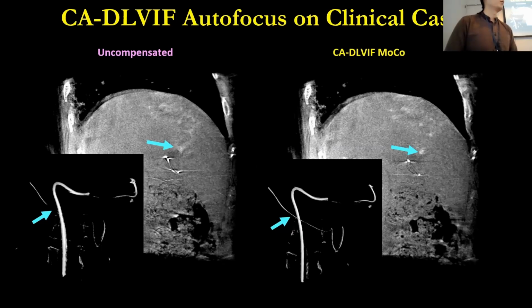Yeah, thank you very much for the question. So the first thing I would say is this motion vector field estimation is really hard. That's why we break it down to partial angle reconstruction, ROI based. Actually, we have another project developing in our lab. It's purely image based. You have a motion corrupted image, and you just put that image in the network, and you generate some motion-free image.